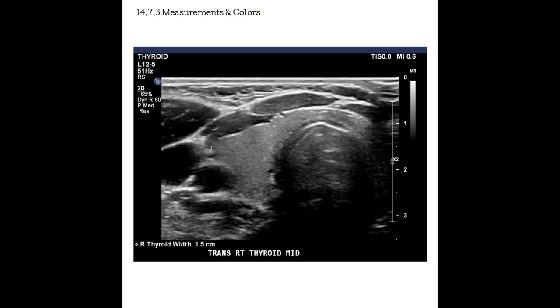Once an image makes it onto our display, then we can actually interact with that image in a few different ways. We can measure things and we can annotate and we can put arrows and all sorts of things. So to measure, what ends up happening is that the display is going to include range marker dots. And those dots are going to align with pixels in the scan converter, and the scan converter knows what depth these pixels came from and how they got mapped into the matrix. So when we pull up our calipers and place them on the monitor, that's going to align with a range marker dot. The machine is going to recognize where it's at in comparison to that range marker dot, and then be able to give us a depth, or if we put two calipers on, then we can do a linear measurement.